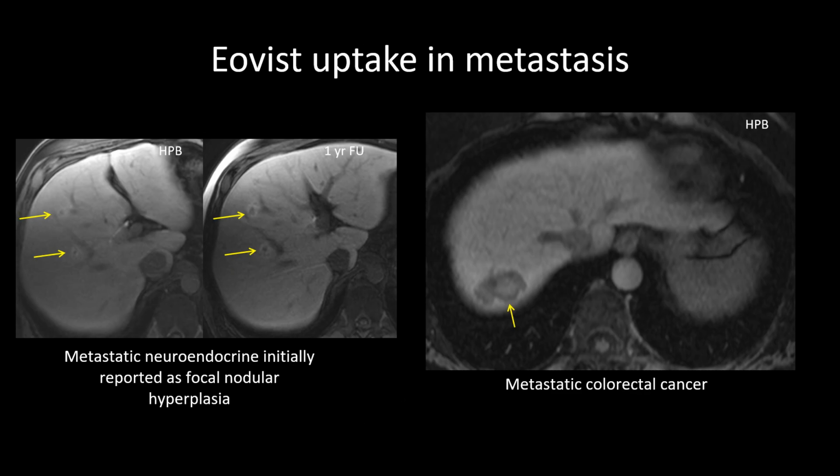Another difficulty with Eovist is isolated reports of Eovist retention in metastatic disease.